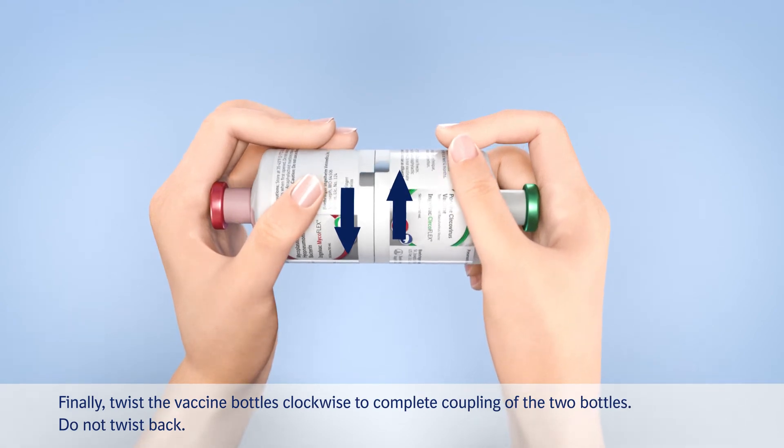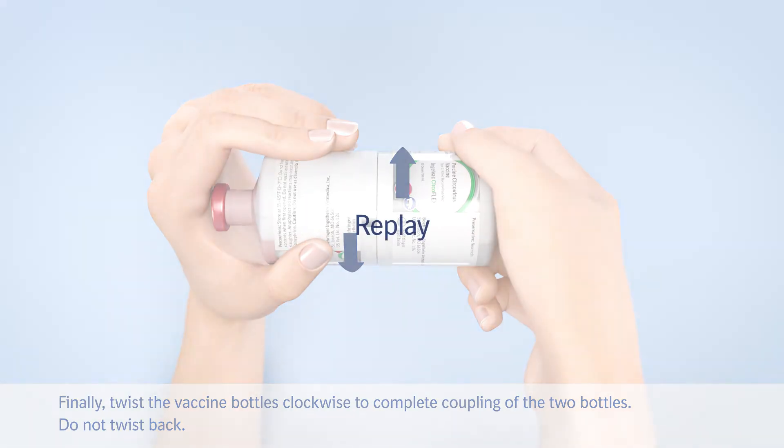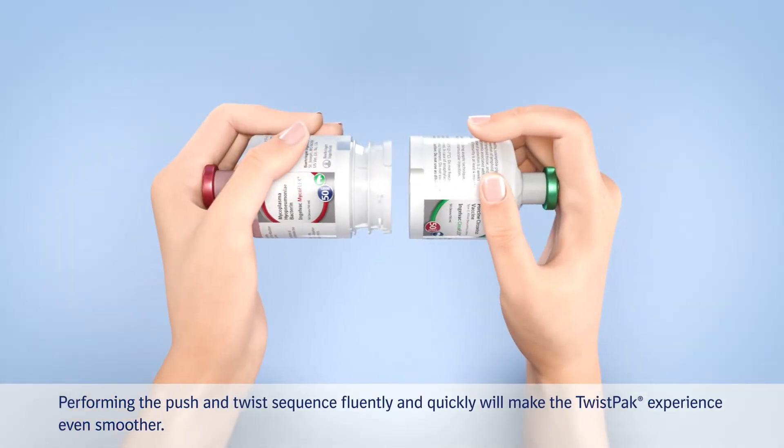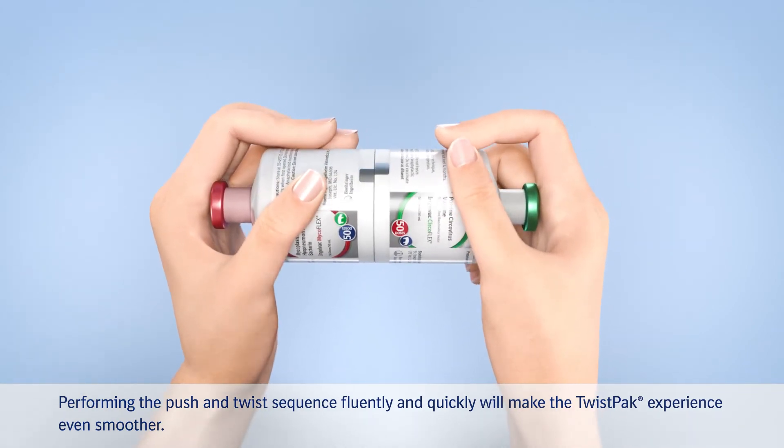Finally, twist the vaccine bottles clockwise to complete coupling of the two bottles. Do not twist back. Performing the push and twist sequence fluently and quickly will make the twist pack experience even smoother.